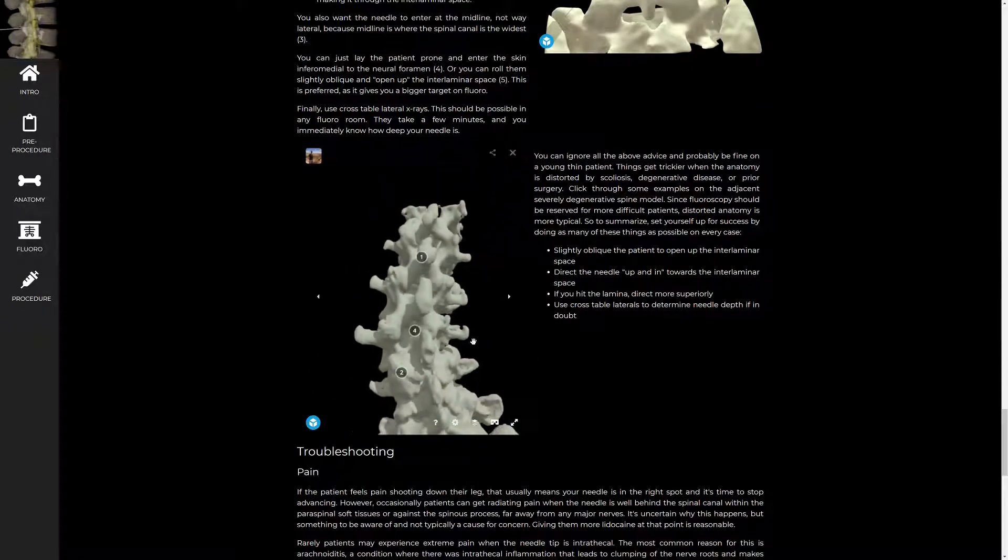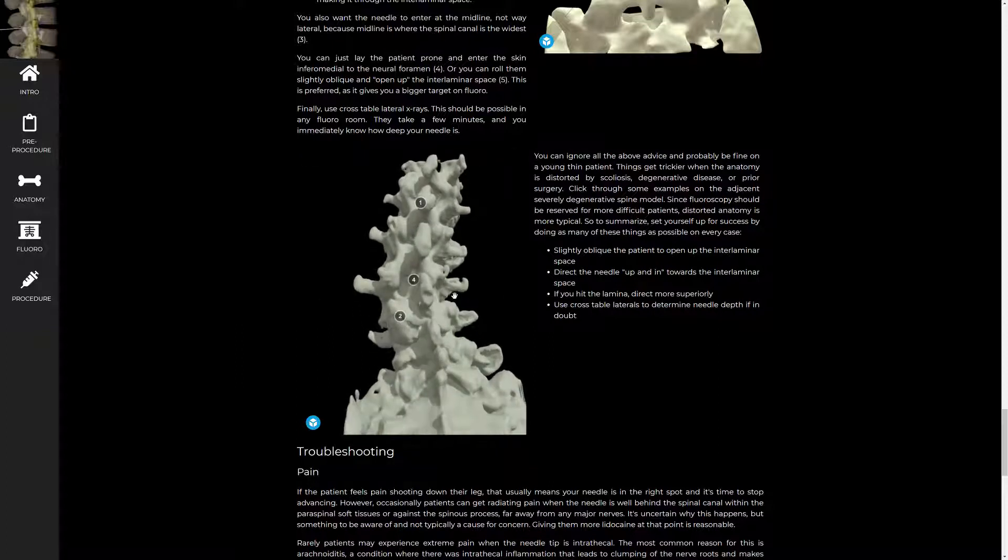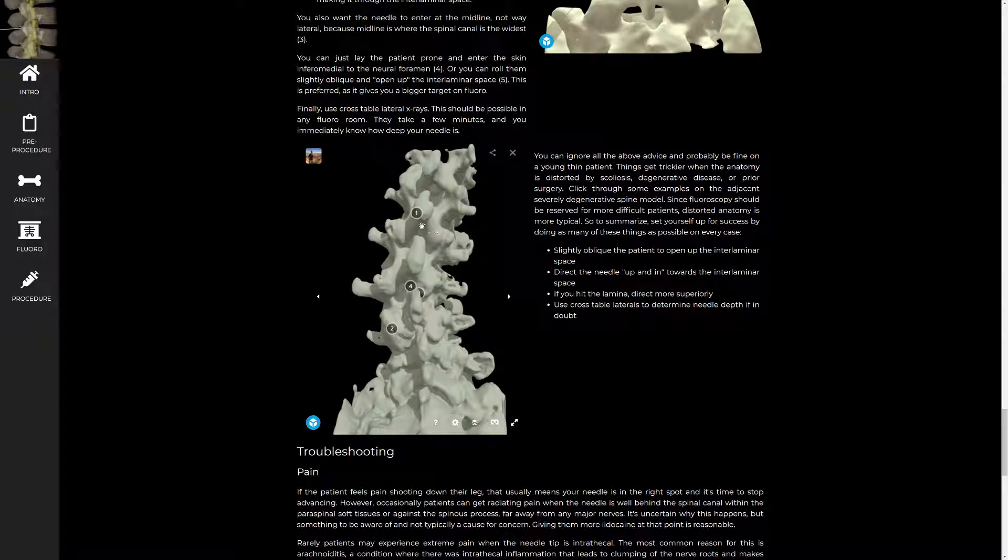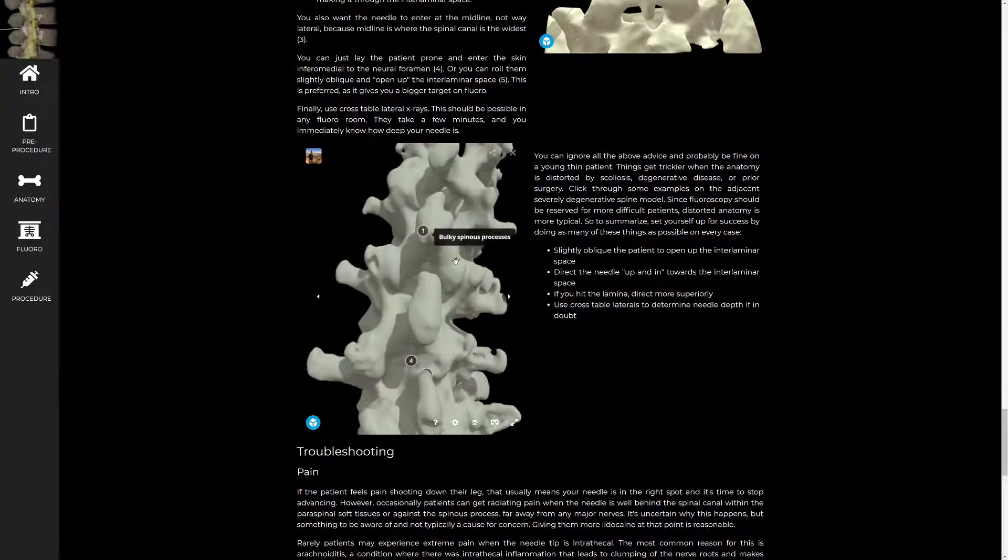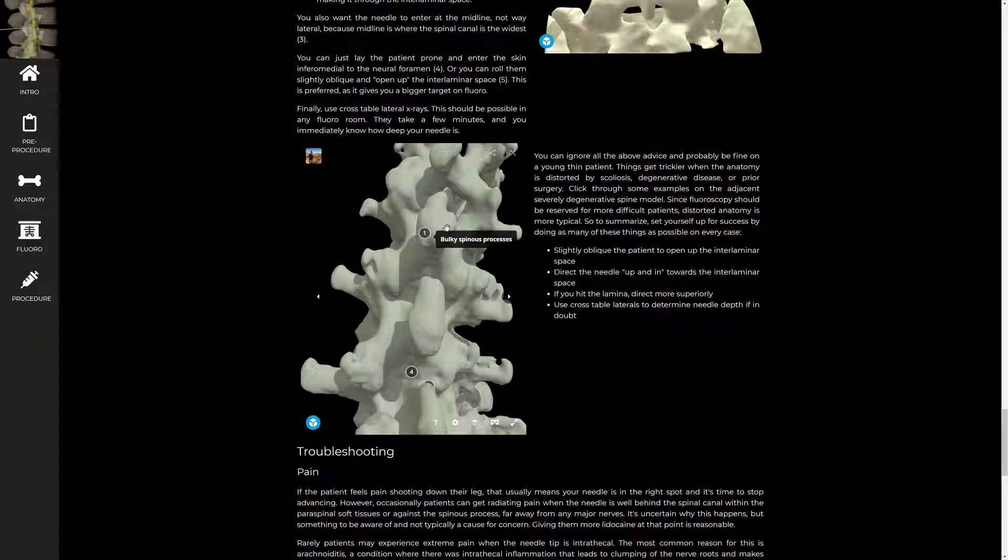I want to show the effects of degenerative disease on a severely degenerative model, the last model on the website. A couple different things worth discussing. This is a spinous process that has bulky osteophytes projecting laterally, and that's what they tend to do.